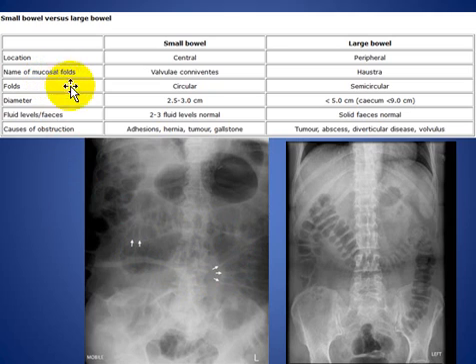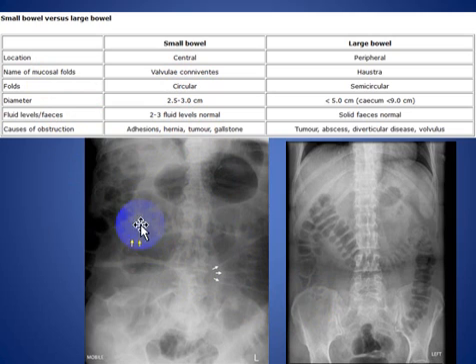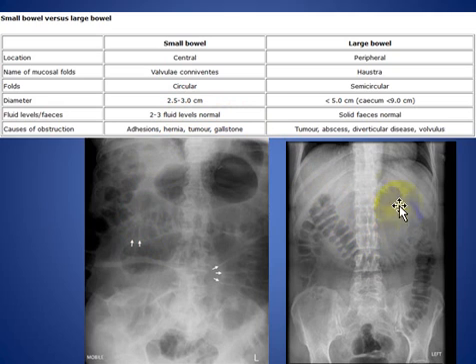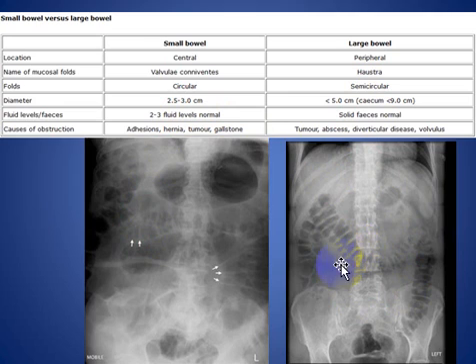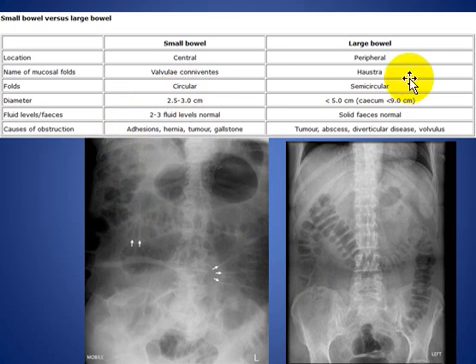What is the name of the mucosal folds in the small bowel? They are valvulae conniventes, and they are continuous from one side of the wall to the other side of the wall. In the large bowel, the mucosal folds are called haustra, and they are not continuous from one side to the other — they are incomplete. Folds are circular in the small bowel and semicircular in the large bowel.